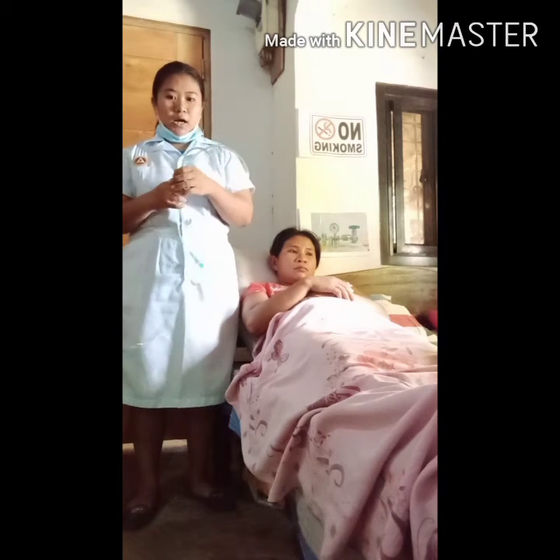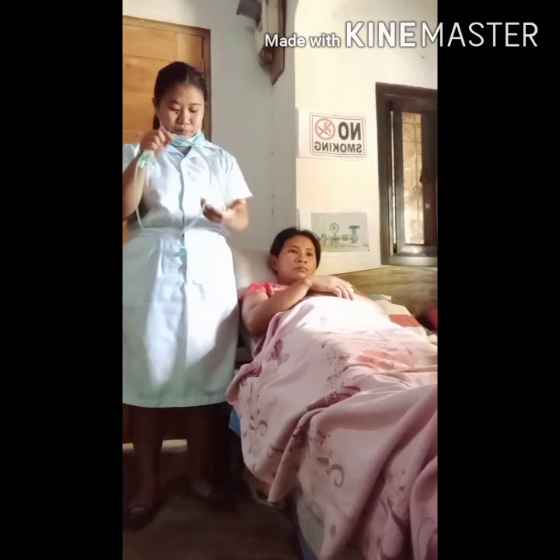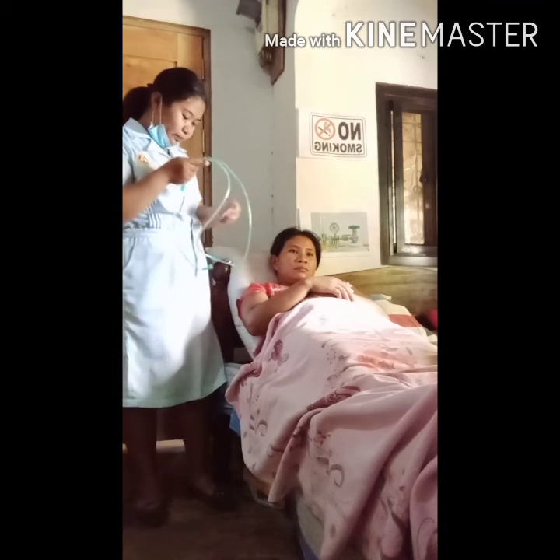And then hold the nasal cannula in proper position with the prongs curving downward, and then place the cannula prongs into the nares.